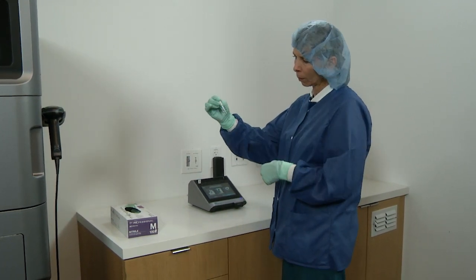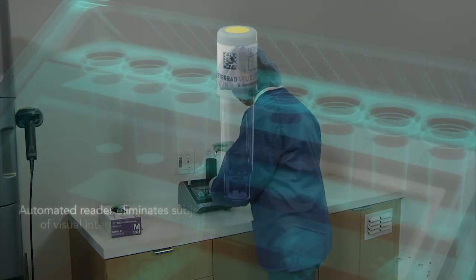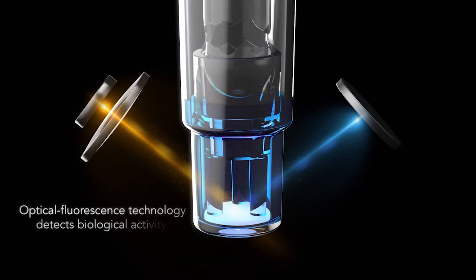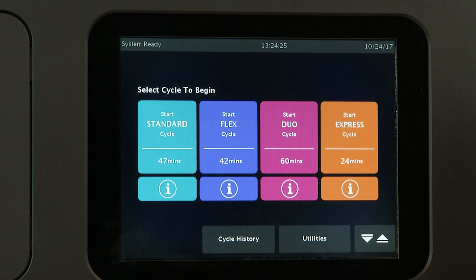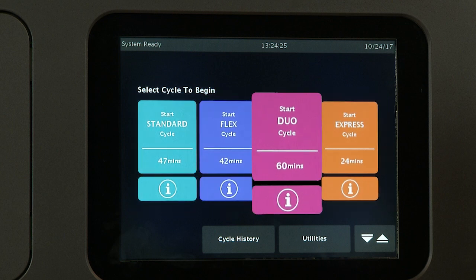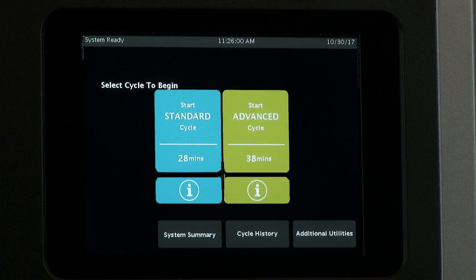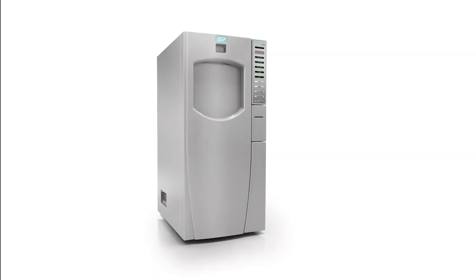Biological monitoring provides the only direct measure of lethality of a sterilization cycle. Therefore, it is to be used as a standard method for monitoring each of the following STERAD sterilization system cycles: the standard, flex, express, and duo cycles of the STERAD 100NX with and without all-clear technology; the standard and advanced cycles of the STERAD NX with and without all-clear technology; and the STERAD 100S.